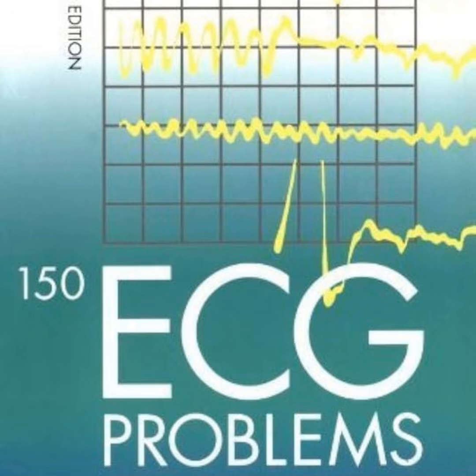So imagine you've got a 50-year-old patient crashing right in front of you. They are cold, they're clammy, and their blood pressure is completely unrecordable. Oh, that's just a nightmare scenario on the wards. Right, and the monitor is just flashing this insane heart rate of like 300 beats per minute.